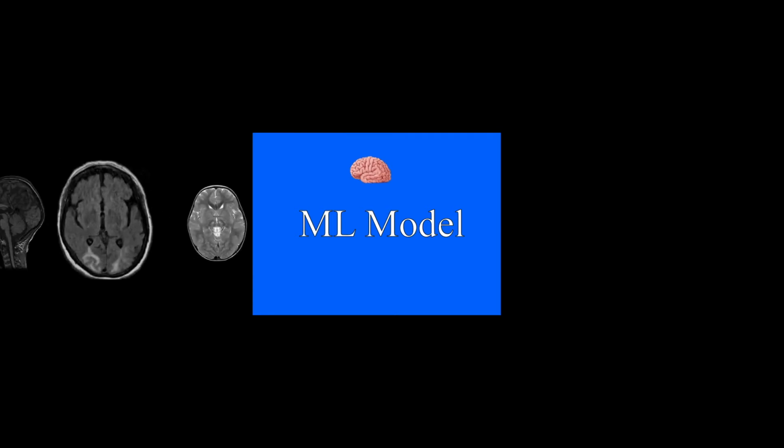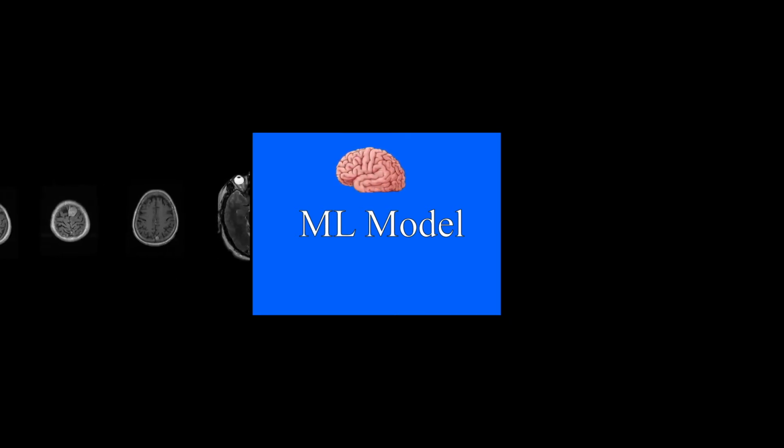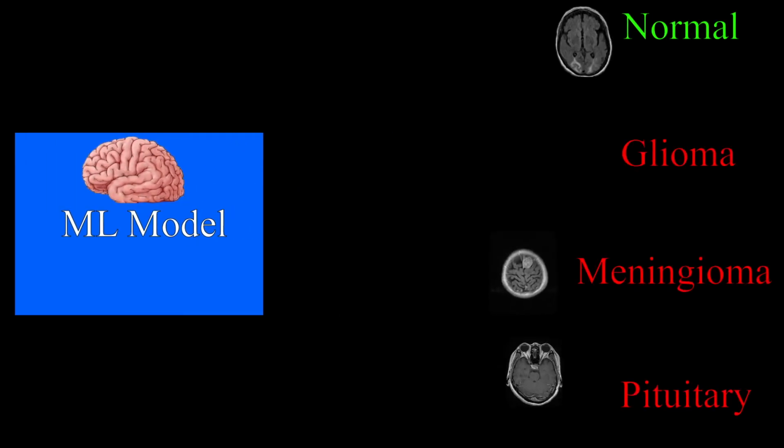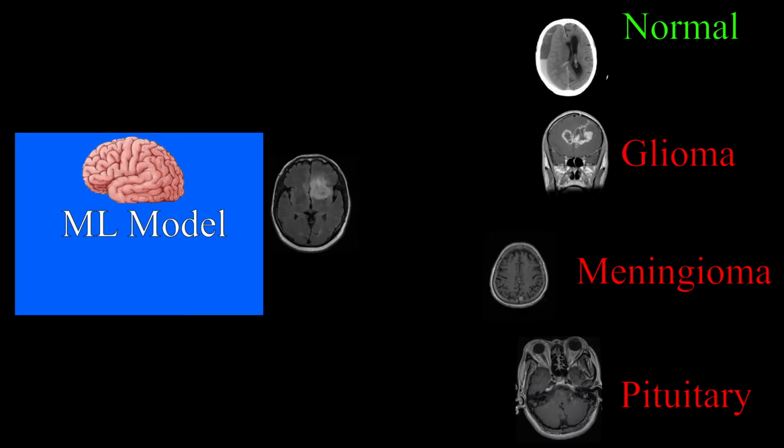The model is trained using MRI scans of both normal brains and ones with tumors. After training, the model is then able to classify scans based on what kind of tumor they contained.